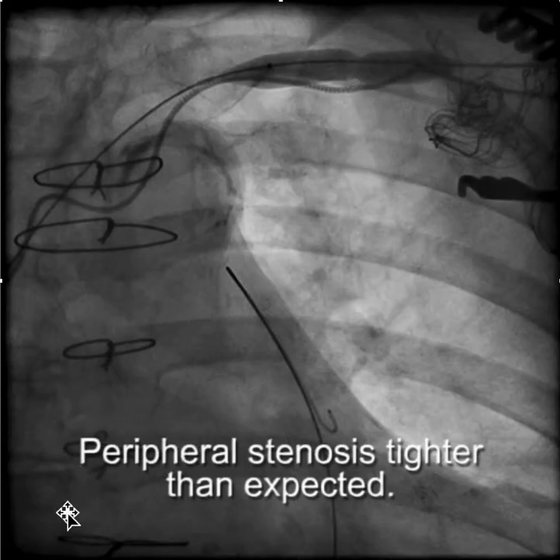That stenosis, which didn't feel so bad when you put the sheath in, was actually contributing to the problem, as well as the tortuosity that you saw.